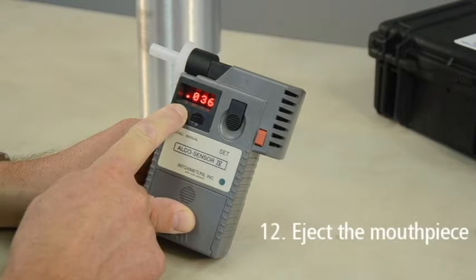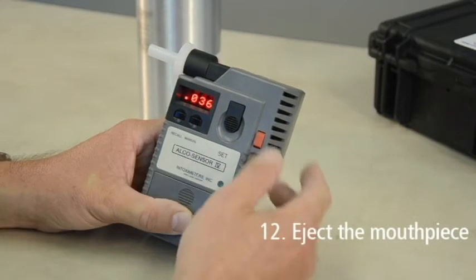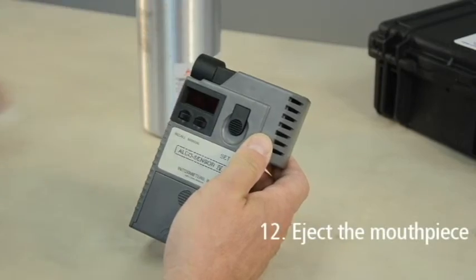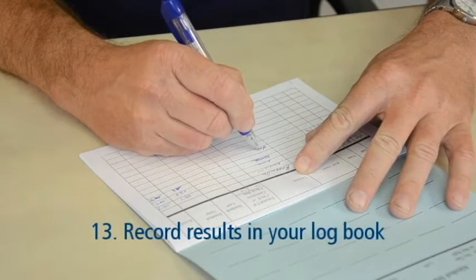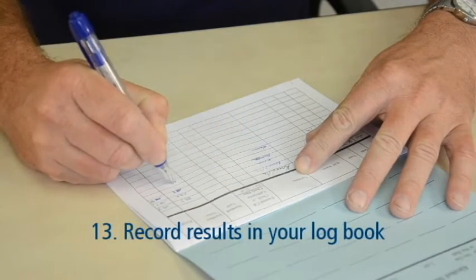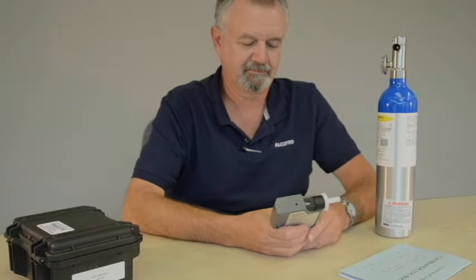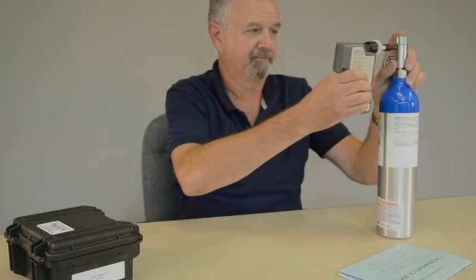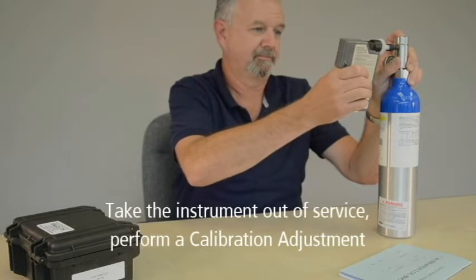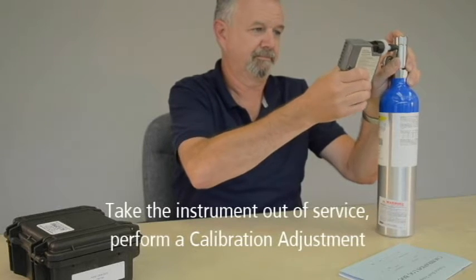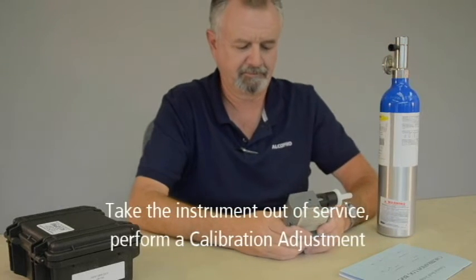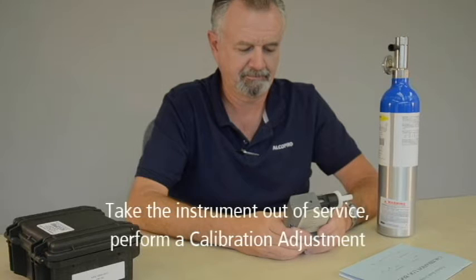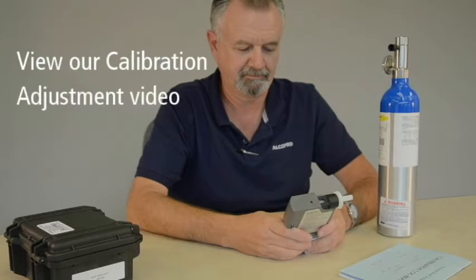When you hear the beep, press the red button and eject the mouthpiece. Record the accuracy check result in your logbook. If the result of your accuracy check falls outside of the acceptable tolerance range, you must take the instrument out of service and perform a calibration adjustment to bring the instrument back into an acceptable tolerance range. You can view the Alkosensor 4 calibration adjustment video for step-by-step instructions.